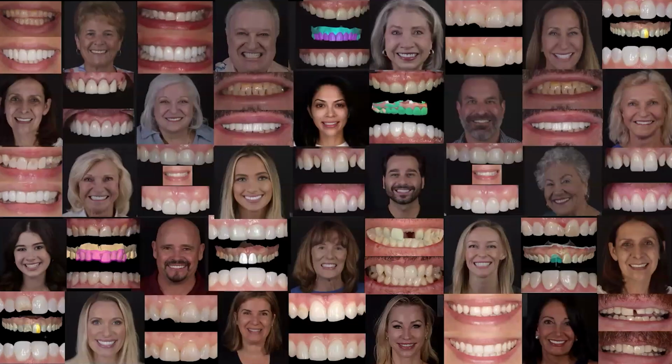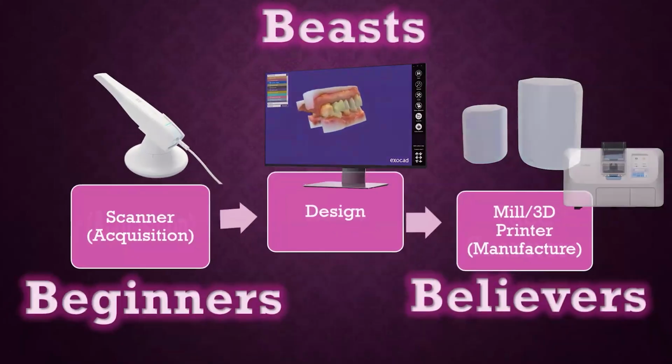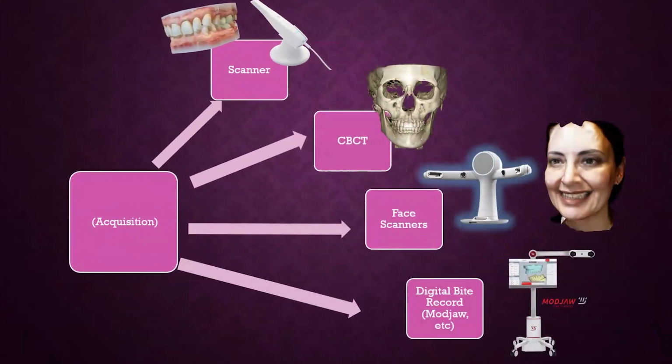So now this slide is quite humbling to me. All of these cases that you see on here are designed by me in-house. Some of these are composites that I did myself, and some of these are ceramics that I had transitioned over with my ceramist. In today's day and age, acquisition looks much different than just a scanner.